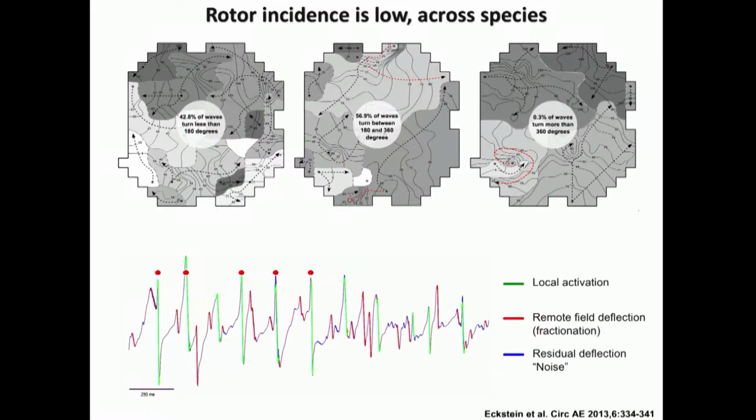We come from a different tradition also in the analysis of atrial fibrillation. We very much believe that it is still, even after the introduction of phase mapping into the world of electrophysiology, possible to analyze fibrillation electrograms based on the actual annotation of activation time. It's nowadays a little bit the tendency to say that this is not possible anymore. Why shouldn't it be possible anymore if we did it for a couple of decades in a successful way? I don't understand this either. So what we do is we have those unipolar electrograms, and we identify large deflections.